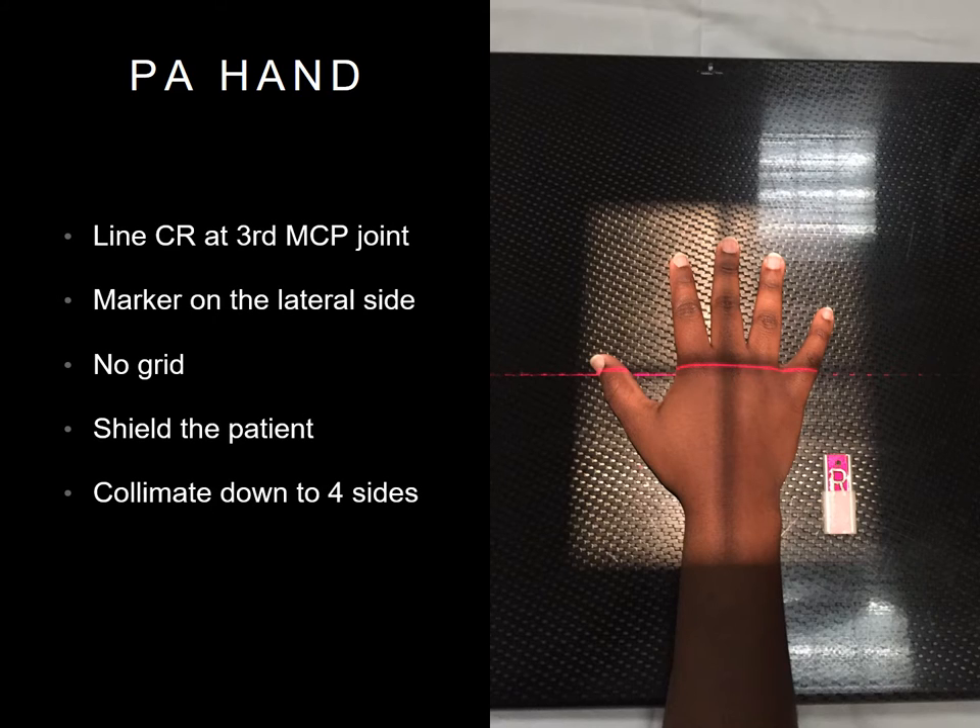Your first position will be a PA hand. Your central ray will be on the third MCP joint. You will not use a grid. Collimate to all four sides of the hand, and place your marker on the lateral side of the hand, although your tech may have a different preference for your marker placement.